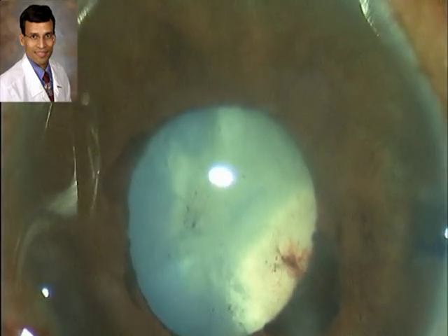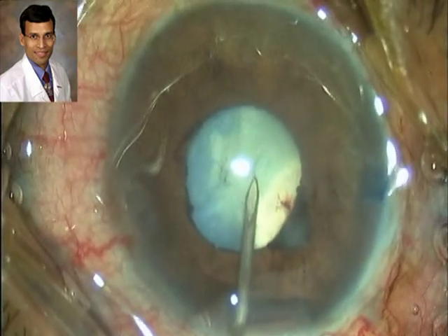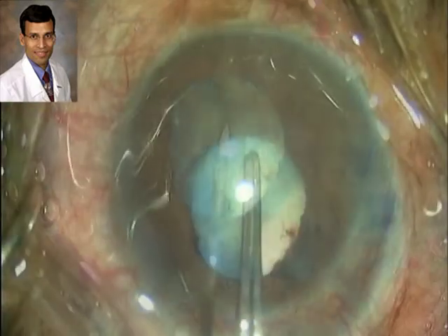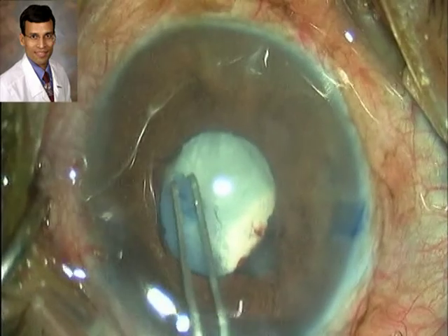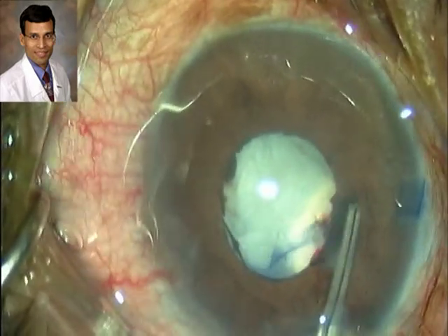However, in these traumatic cases, in some selected cases, it can give very good results and give a fairly adequately sized pupil. Once we have an adequate sized pupil, we perform capsulorhexis, which again has to be very careful because the capsule may be fibrotic and adherent to the iris.